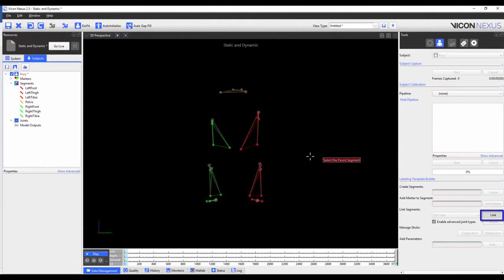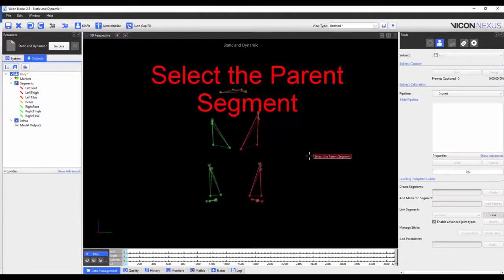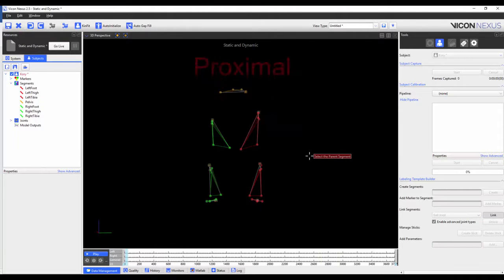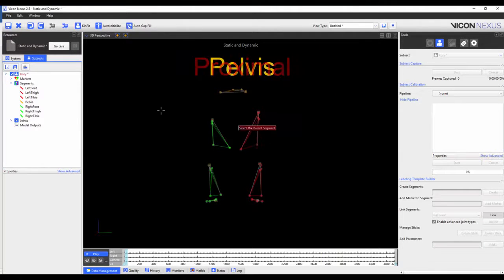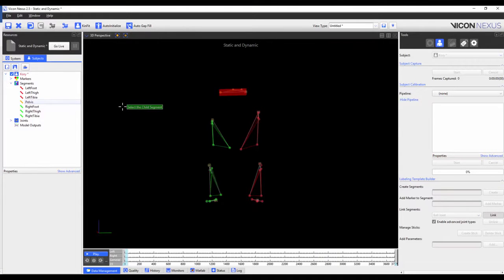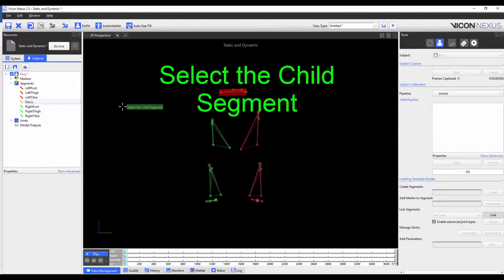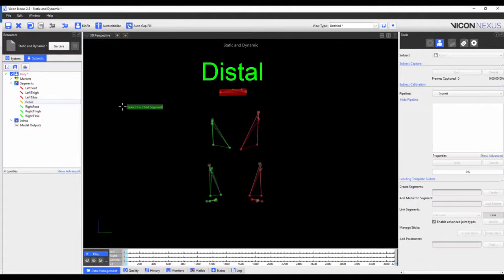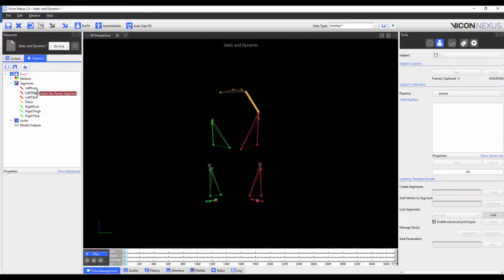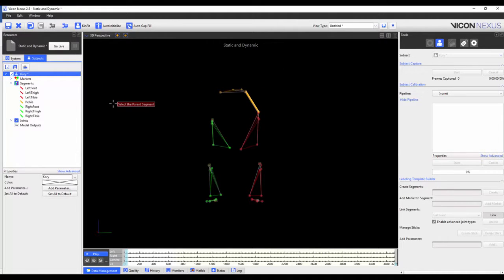When I click on link, it will prompt me to choose the parent segment, which will be the proximal segment — in this case the pelvis. It will then prompt me to pick the child segment, which will be the distal segment — in this case the left thigh. I'm going to repeat the process until all segments are linked.